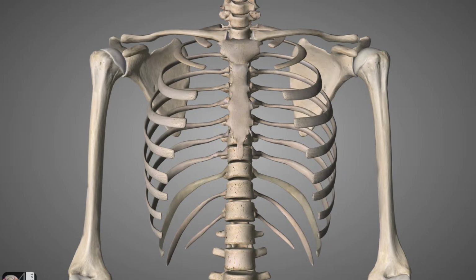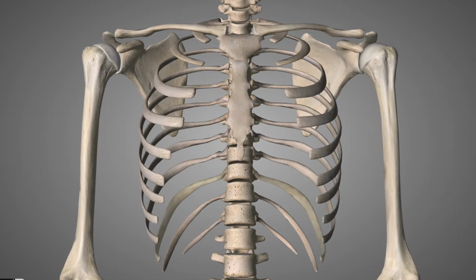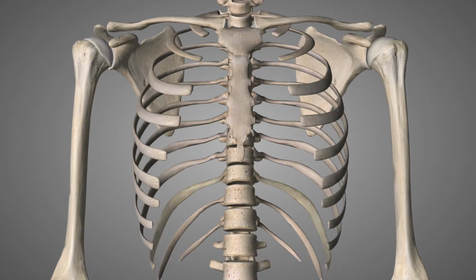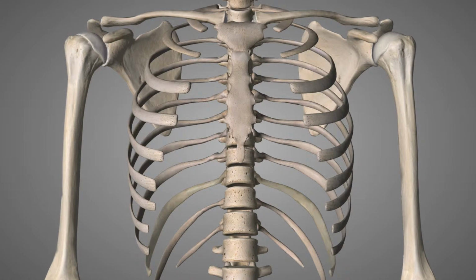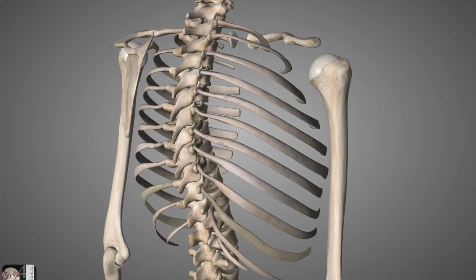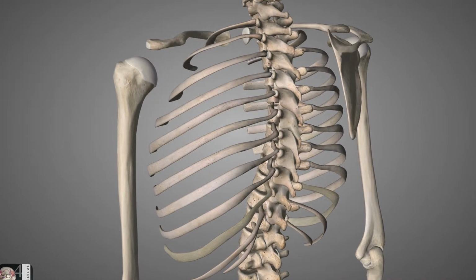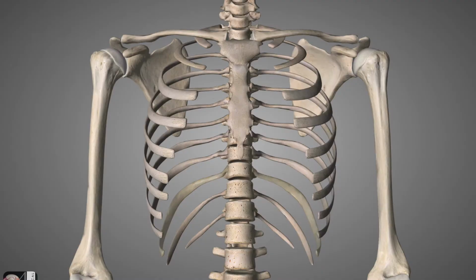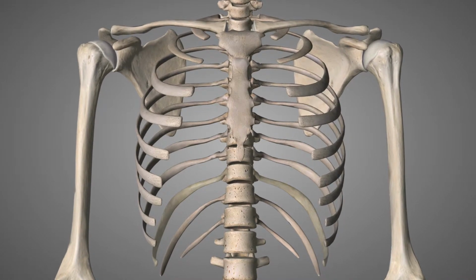When you're doing oblique ribs, it is very important to know what position to put your patient in because depending on your patient, your positioning could vary. For example, if your patient is having anterior rib pain, you're going to put them in a PA projection, and you're going to turn the affected side away from the board. So the best way to remember that is anterior away. And then if you think about it vice versa, if your patient is having posterior rib pain, then you're going to put them in an AP projection.